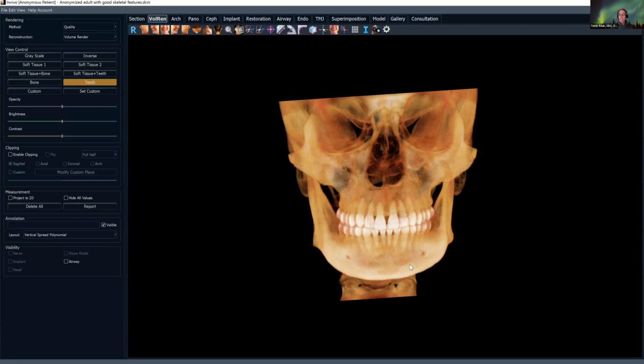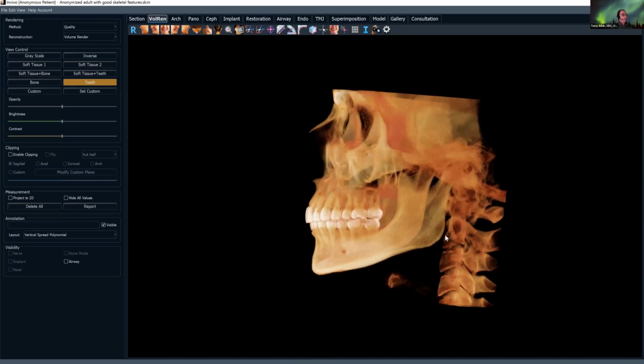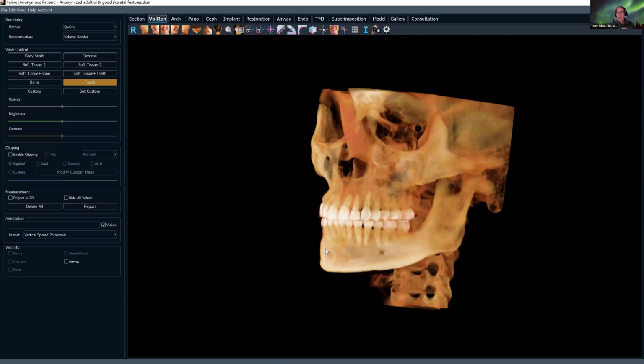Most of the scanning machines out there can deliver a very high quality image. So you should become familiar with the settings to yield this level of detail. So I look at the full volume. I just kind of look at what I'm dealt with, and I've selected what I think is a pretty anatomically correct young adult with a good image quality because I want to demonstrate as much as possible these anatomic features as we go through them.